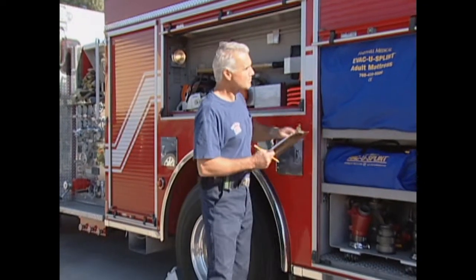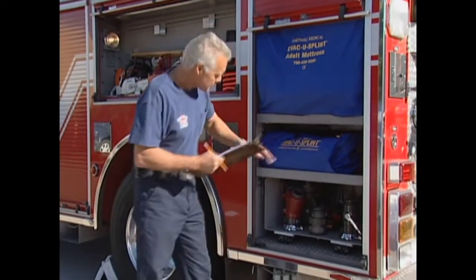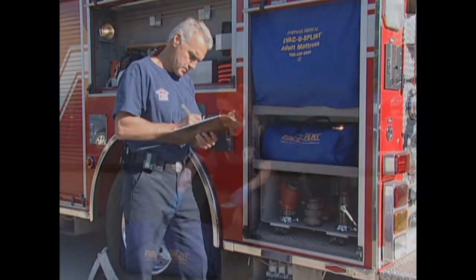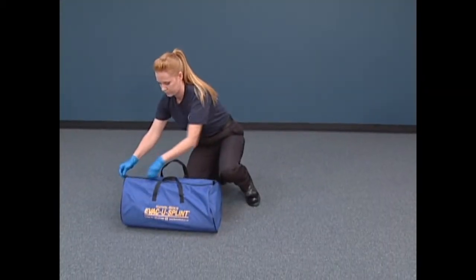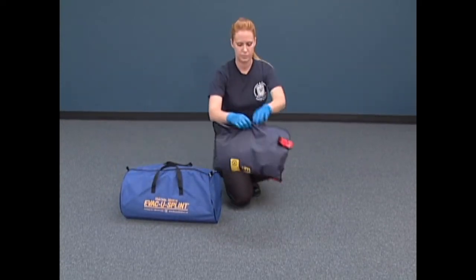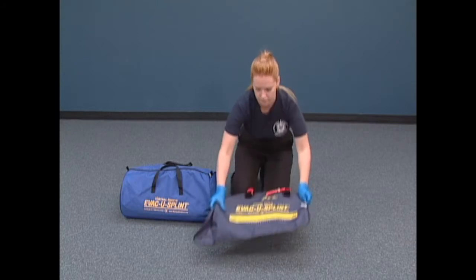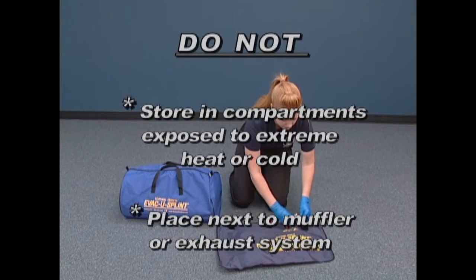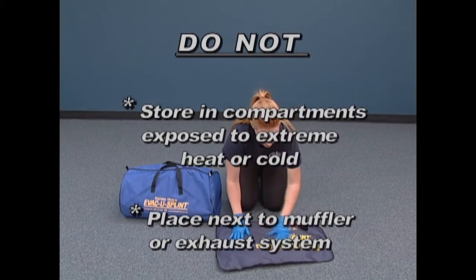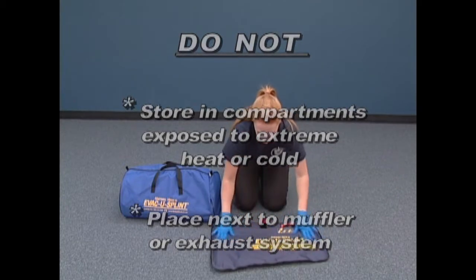The EVAC-U-SPLINT set comes in a carry case that easily fits in most vehicle compartments or under a squad bench. The splints and the manual pump should always be stored in their carry case to reduce the potential for soiling or damage. They should not be stored in compartments exposed to extreme heat or cold and should never be placed next to a muffler or exhaust system in a vehicle.